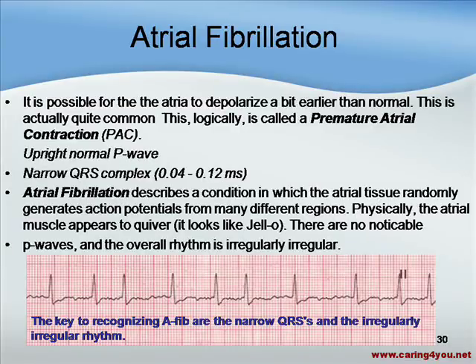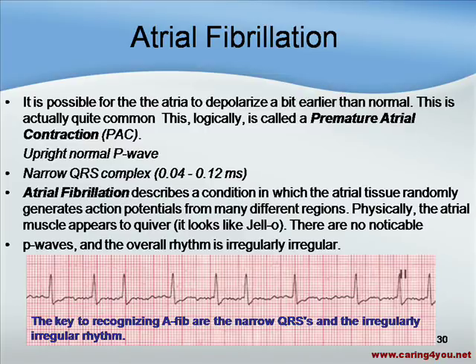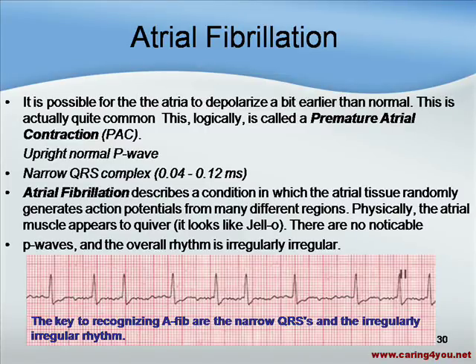The key to recognizing A-fib is the narrow QRS complexes and the irregularly irregular rhythm. You can see on the strip that there's no regular pattern — it's all over the place, completely irregularly irregular.